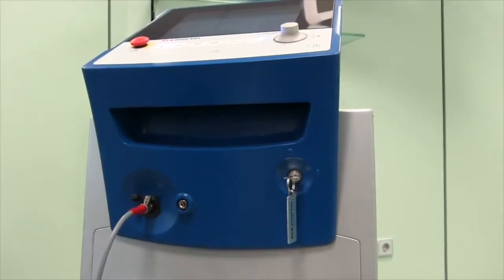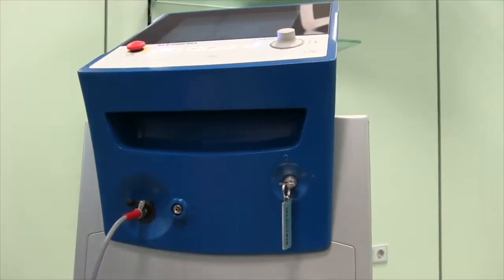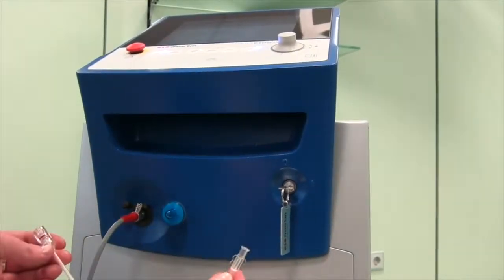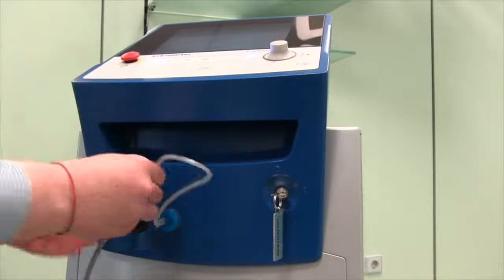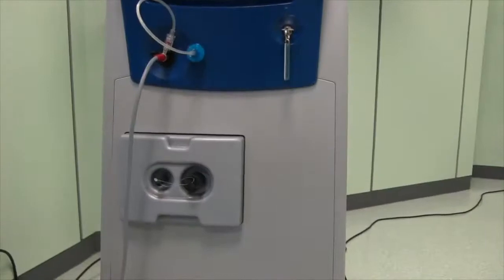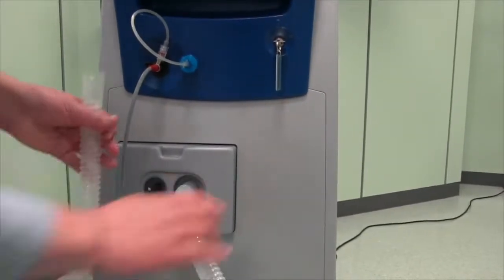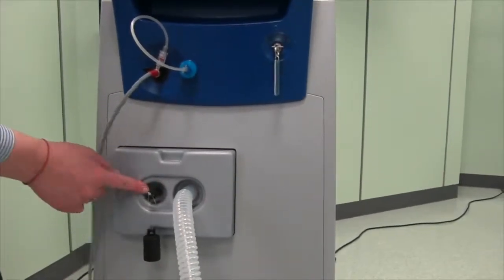If a focusing handpiece or a gas irrigated fiber is used, the sterile air filter can be optionally connected to the luer lock socket air. Now an air connecting tube is connected to the sterile filter and the supply fiber. Using the smoke evacuator, please plug the suction hoses to the VAC socket of the smoke filter. The VAC socket which is not used needs to be closed with the cap supplied.